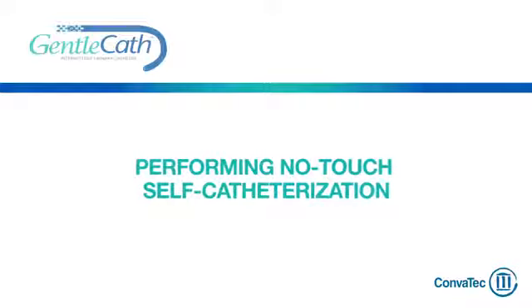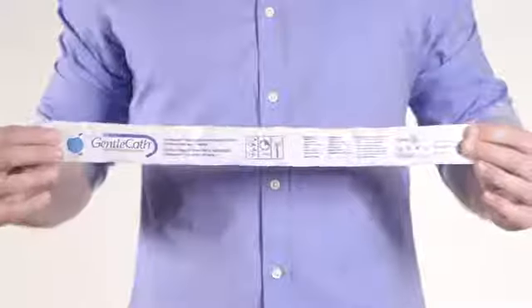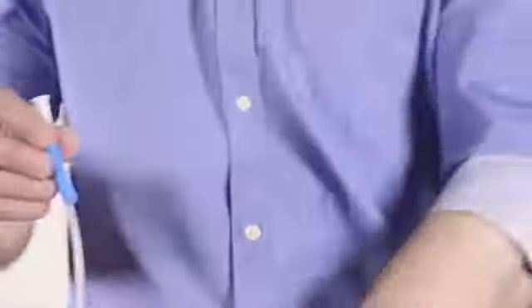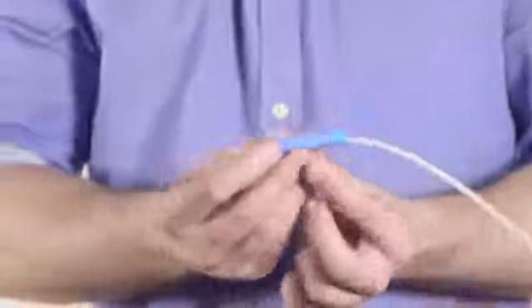Your Gentle Cath Hydrophilic catheter is now ready for use. Simply open the package by peeling the tabs at the connector end and remove the catheter. Remember to keep the top of the pack upwards to stop water from running out of the pack.